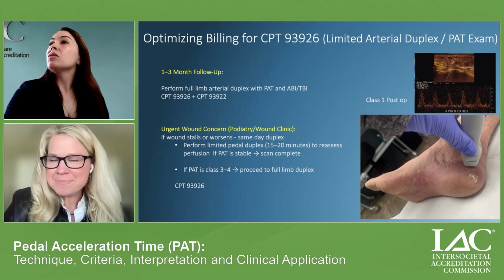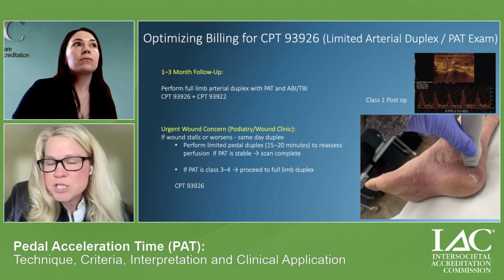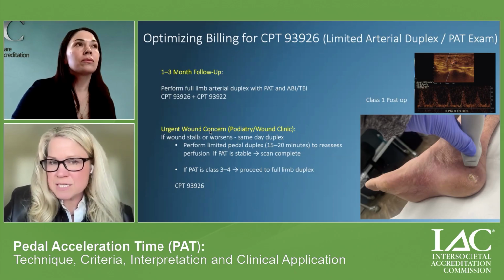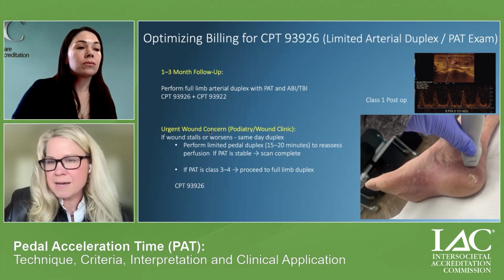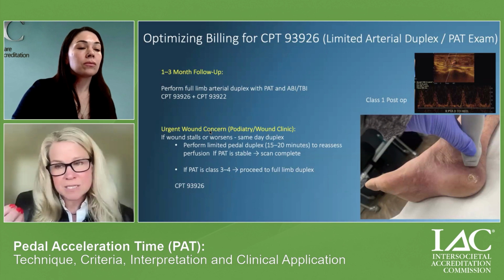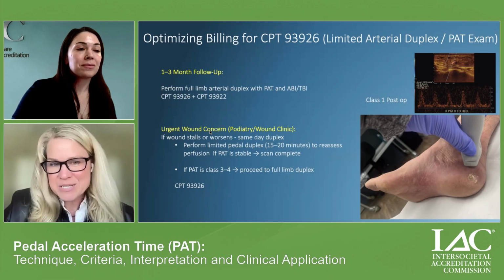If you have a patient with no wound with a class 3 or 4 PAT, would they need an intervention? It just depends on the patient and the vascular specialist's decision. But generally, this patient has ischemic rest pain if that's what they present with. Of course, we always treat the patient, not the image. So PAT is just an additional tool that we can provide for any of that clinical decision making.